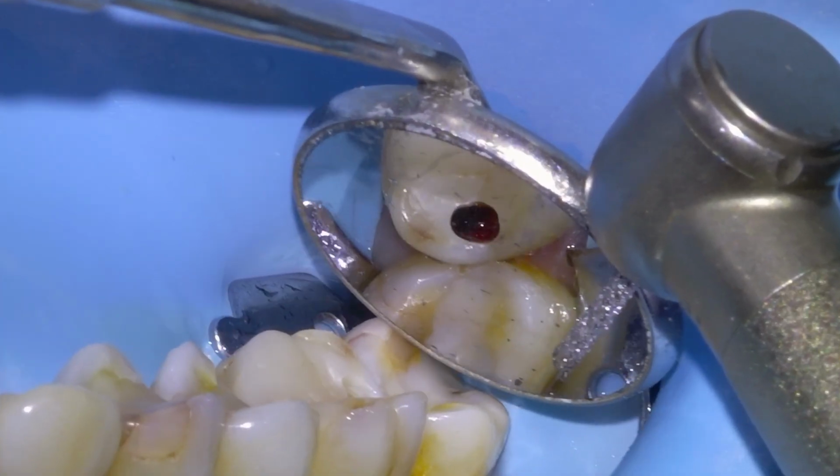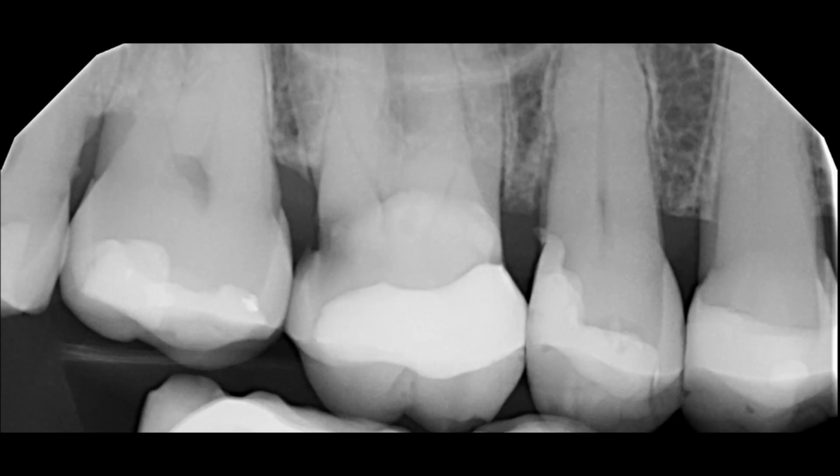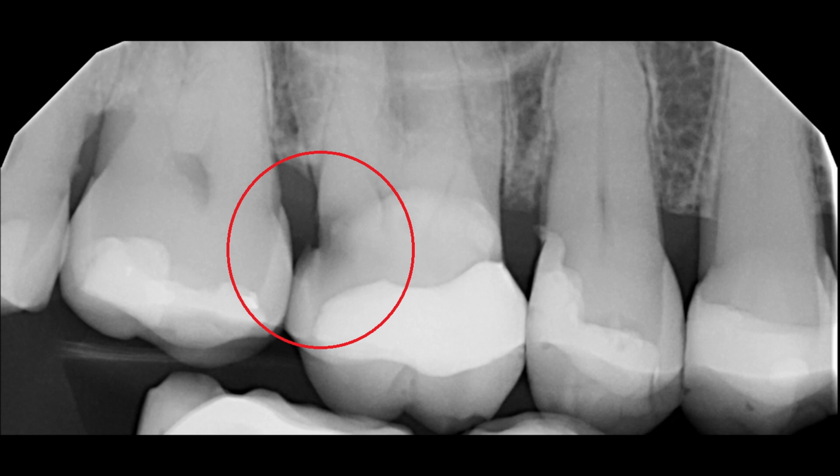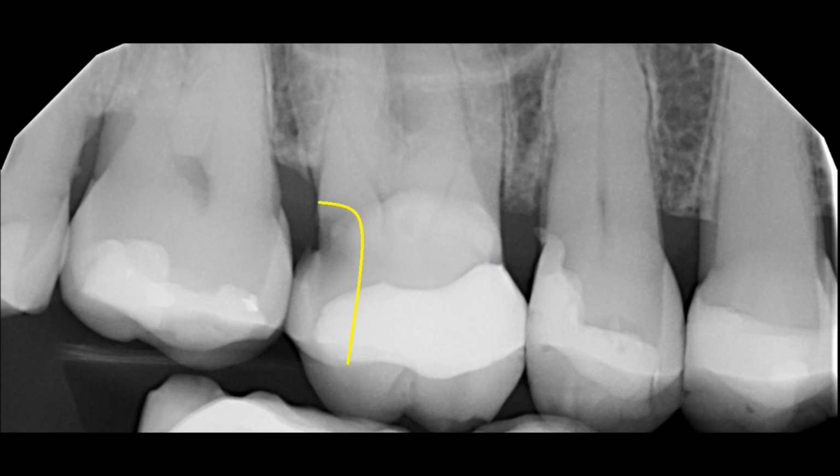This is a deep cavity that we're going to be fixing in this video. Here's an x-ray of the tooth, and you can see that there's a deep lesion on the distal surface of the first molar. The tooth had a large existing Emax onlay, and the treatment of choice certainly would have been a crown, but since this was cost prohibitive for the patient, we made a plan to perform a direct restoration, and in this video we're going to go over that procedure.